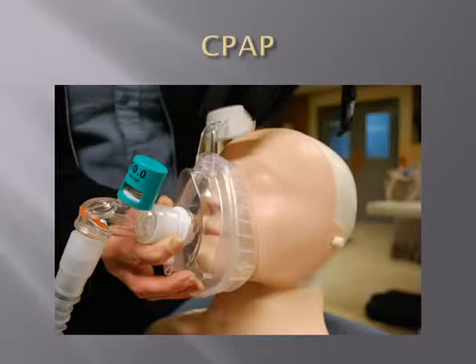After you have the oxygen flowing through the CPAP device, explain to the patient what you're about to do. Then go ahead and place the mask on the patient's face. Make sure you get a good seal all the way around the device.